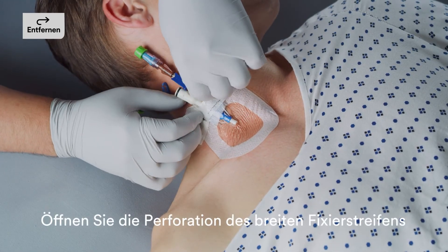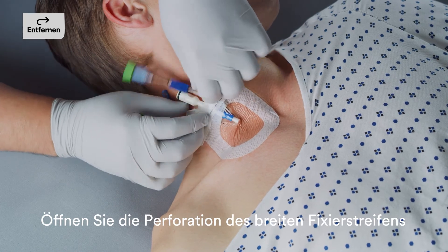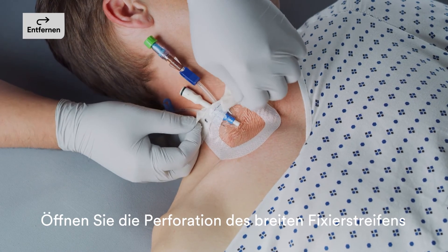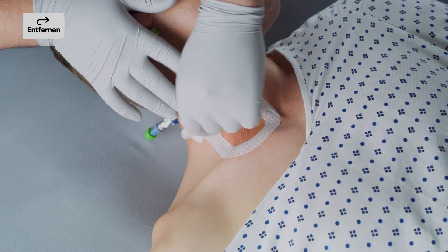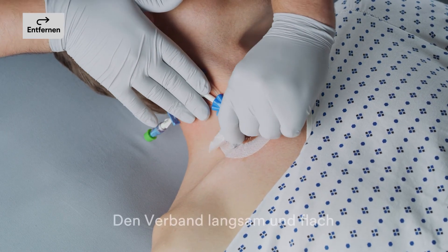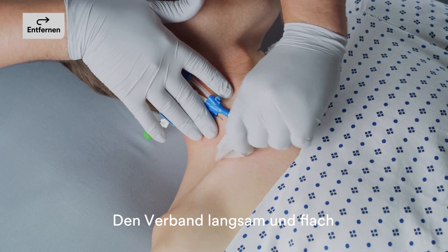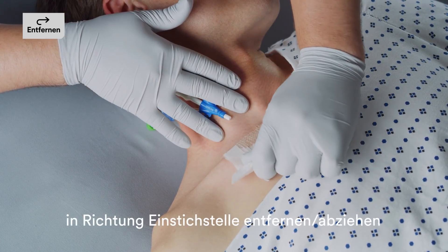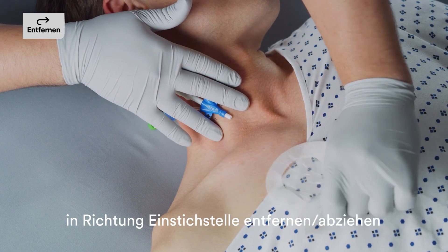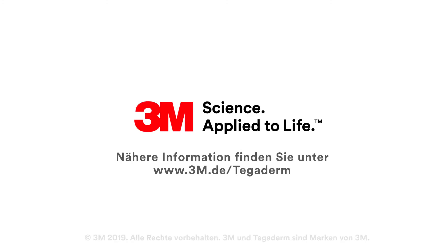Open securement tape strip perforations. After opening perforations, hold the securement tape strip and peel back the dressing toward the catheter insertion site using a low and slow removal technique. Avoid skin trauma by peeling the dressing back rather than pulling it up from the skin. Continue the low and slow removal method until the dressing is completely removed.